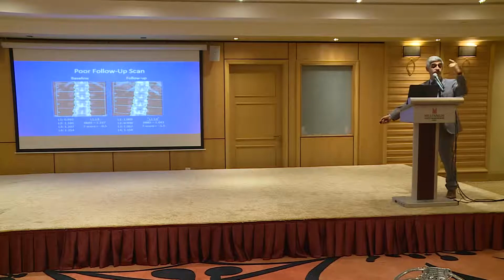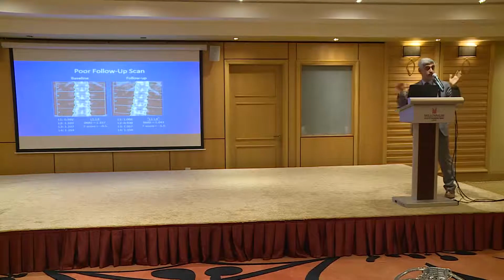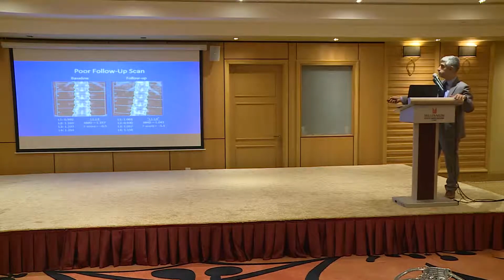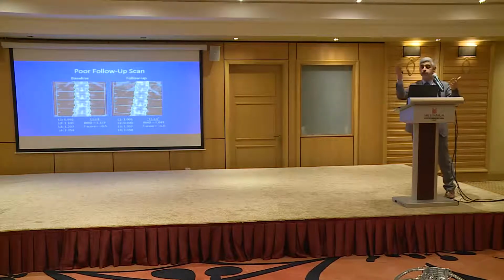So what happened to the density in this patient? It will be lower because T12 has less density than L1. So he will appear to lose bone just because of a positioning error. Okay? So this patient doesn't need to be scanned again. The analysis should be done again on this patient. So this is one of the issues that could develop when you look at the image. Just make sure that you're looking at the right image, basically.